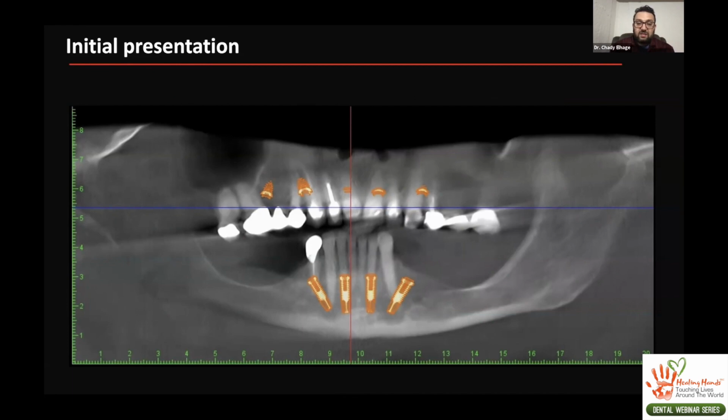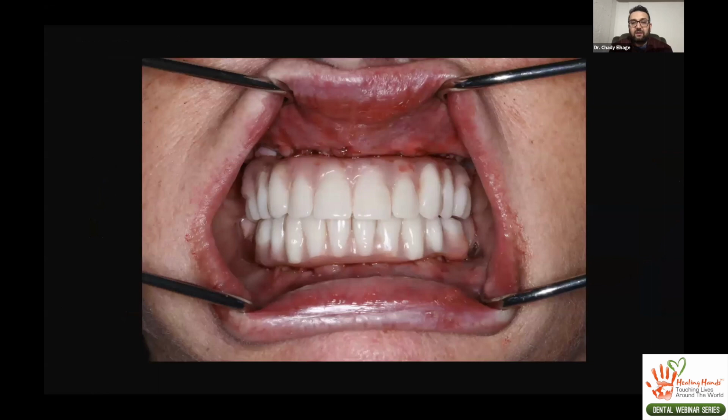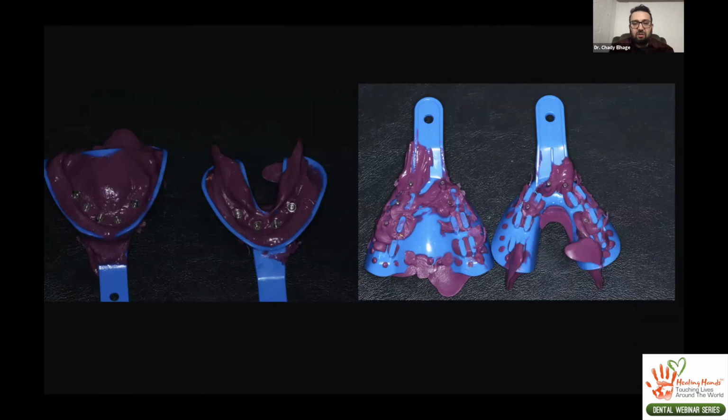This kind of shows you how we set the teeth and create things. Our surgical guides are made. And then we go into surgery and go through the same steps as before and create her temporaries that are placed in. Now we're taking a final impression. These are how we make our jigs. We section them, fit them in place, lute them. Everything is open tray impression. I never take closed tray impressions.